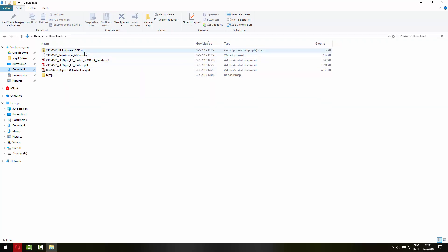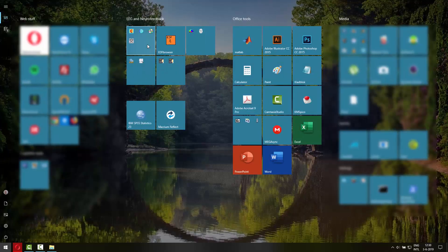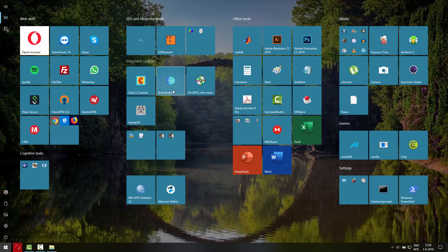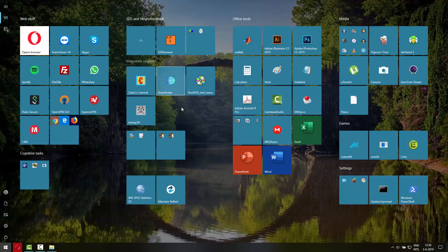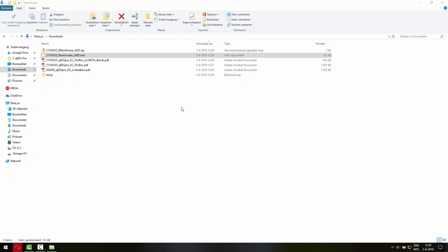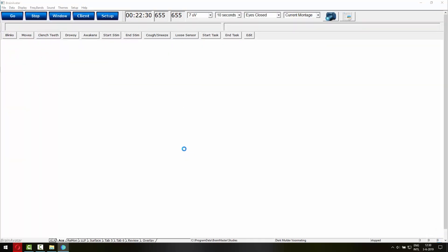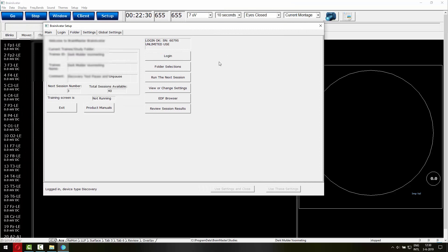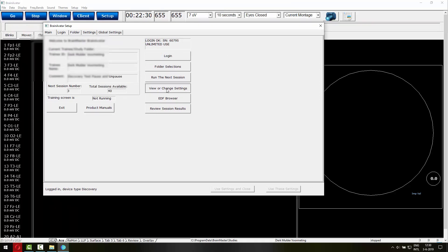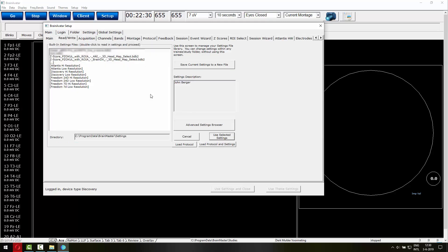So the XML file can be used from the Brain Avatar software. So let's just go to the Brain Avatar software. So if you have the latest version of Brain Avatar and you have your load screen, what you can do is click on view or change settings. Then go to re-write and then you should have this option available, load protocol and settings.